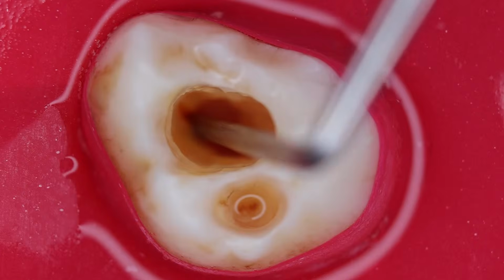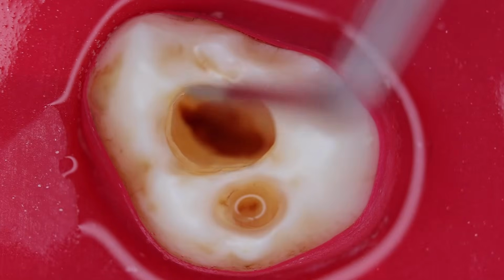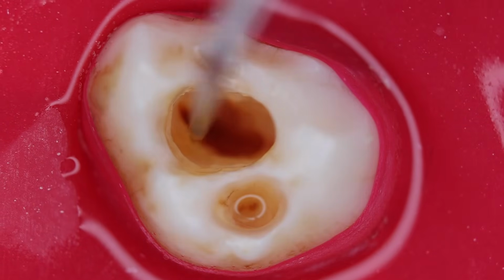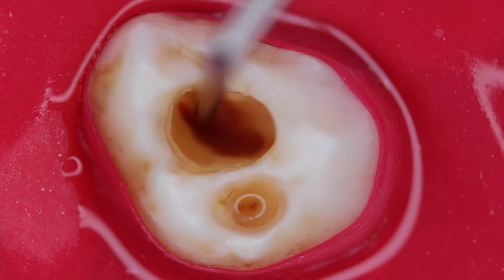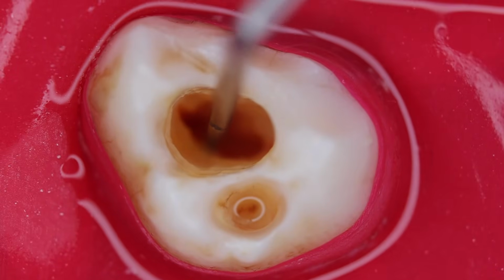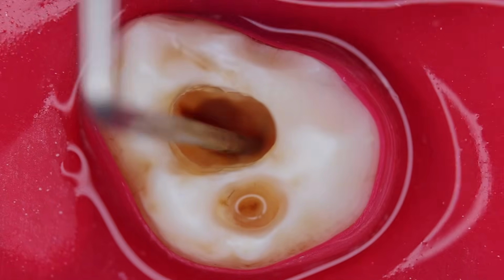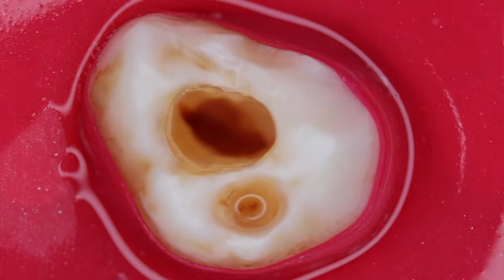Over here, this is the mesiobuccal canal orifice just beneath the mesiobuccal cusp, as you can see. Then there is the distobuccal canal somewhere over here. Your probe should engage into that orifice. And your palatal canal orifice is somewhere over here.